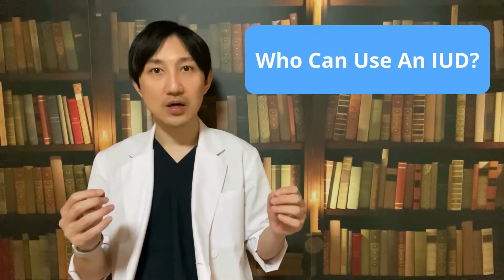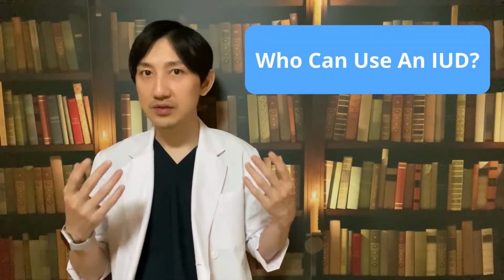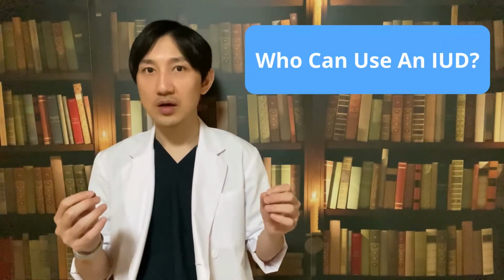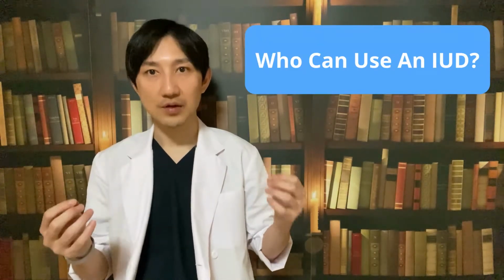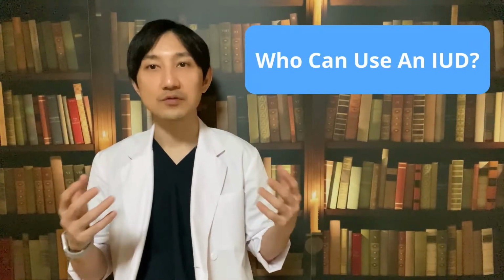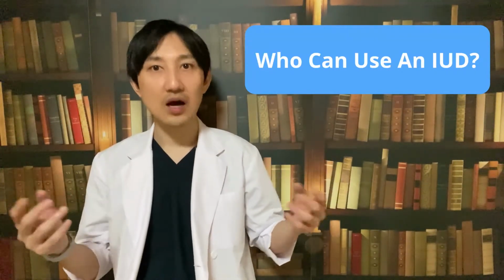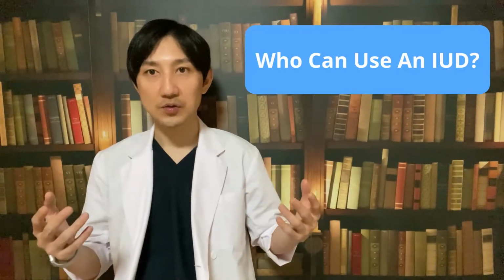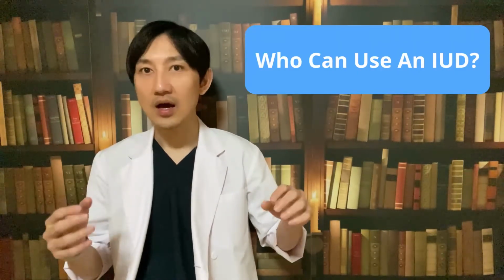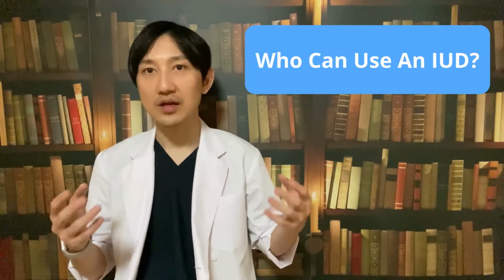In some hospitals, doctors will fit an IUD at the same time as a vaginal delivery or cesarean section. They can also do this if you have a miscarriage or abortion, so you have immediate protection afterwards. If you don't have this done, wait until 4 weeks after giving birth to go to a doctor to have the IUD fitted, and be careful to use another type of contraception until then if you have sex.